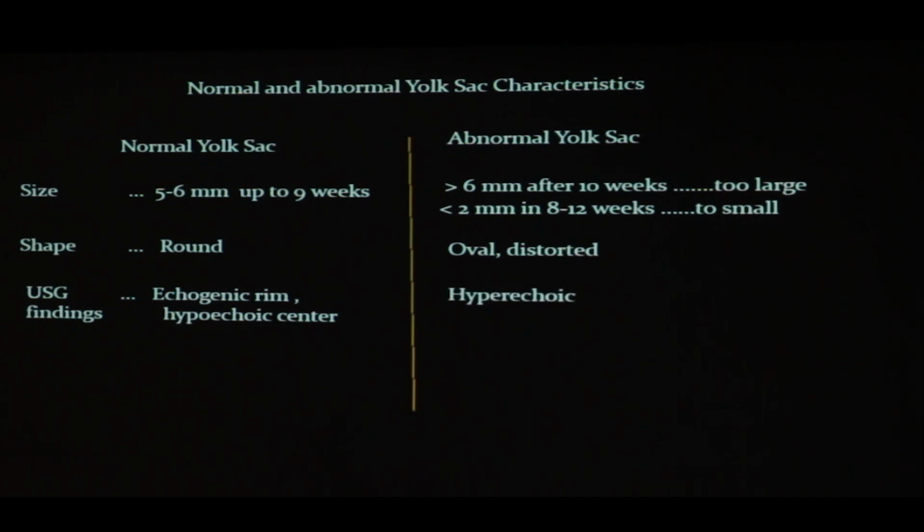And if I am seeing a hyperechoic lumen, that is very much abnormal. That is not contaminated food now. That means that God has put a brick or a stone in the tiffin. So if I am able to put Doppler, there is absence of diastolic flow.